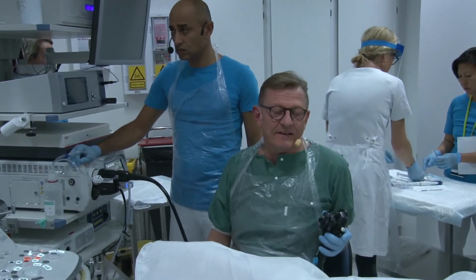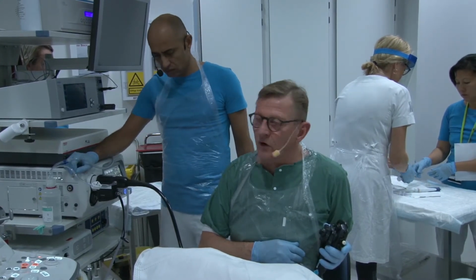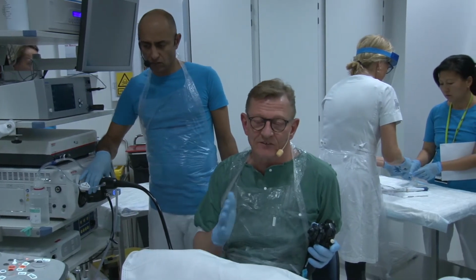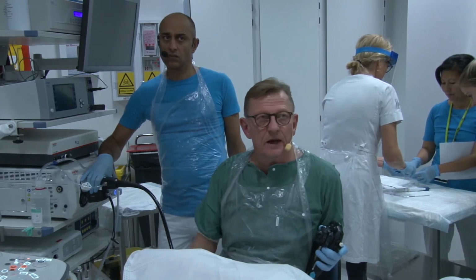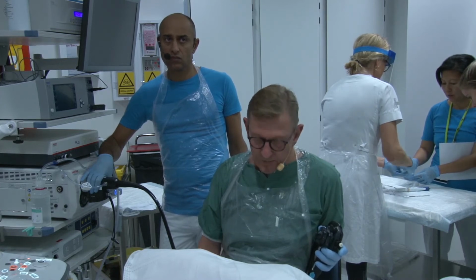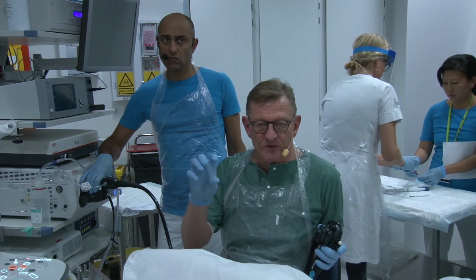As far as when we are doing this study, it is very often difficult both to do microbiopsy as well as CLE, because some of the normal cysts just empty themselves upon penetration, and the longer time there is going, more and more empties.